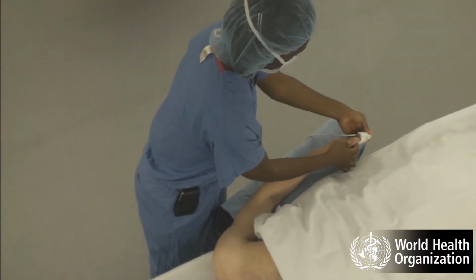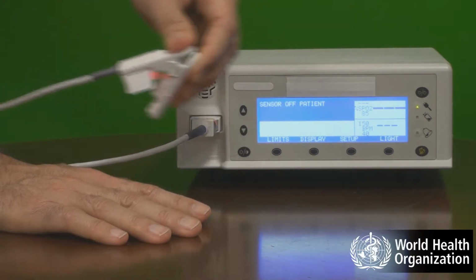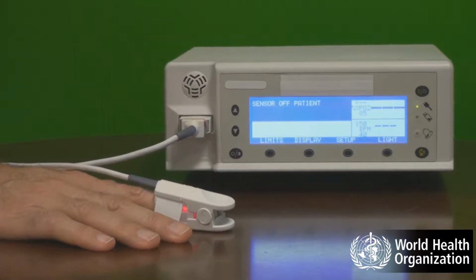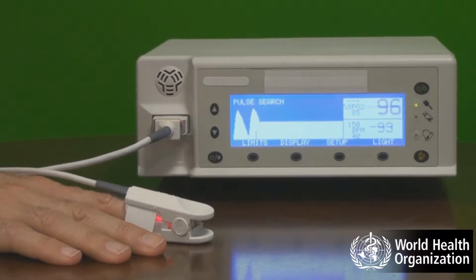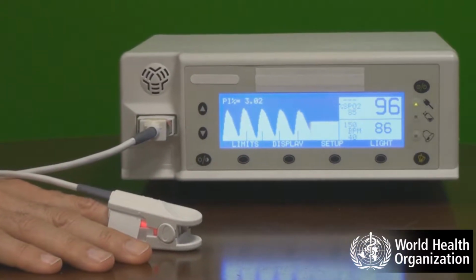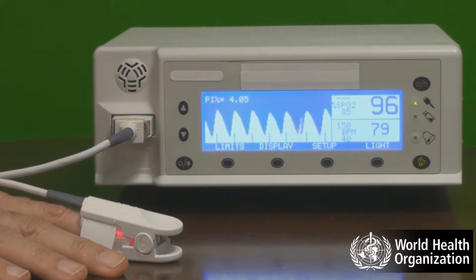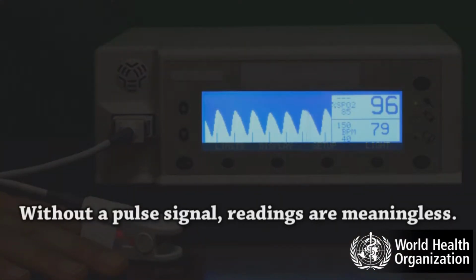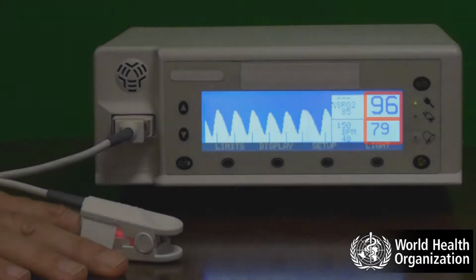Avoid placing the probe on the same arm as the blood pressure cuff. Allow several seconds for the pulse oximeter to detect the pulse and calculate the oxygen saturation. Look for the displayed pulse indicator to ensure that the machine has detected a pulse. Without a pulse signal, readings are meaningless. Once the unit has detected a pulse, the oxygen saturation and pulse rate will be displayed.